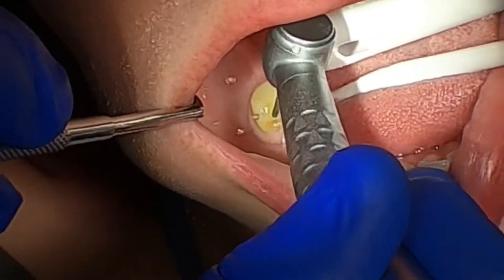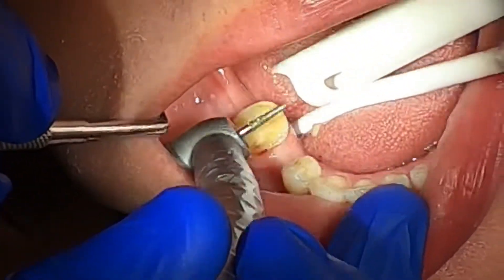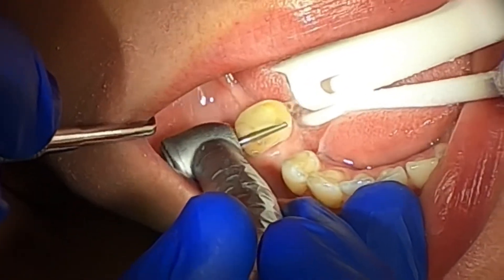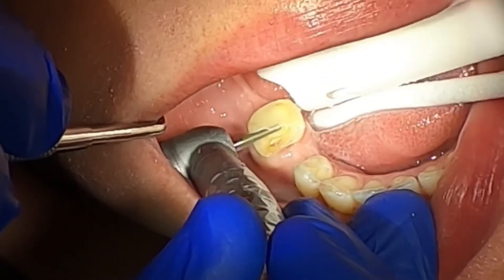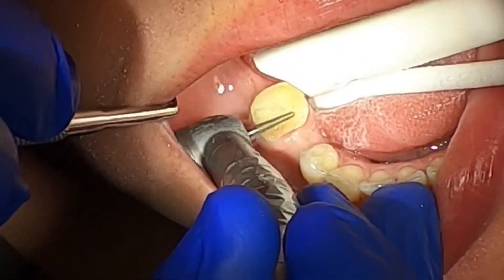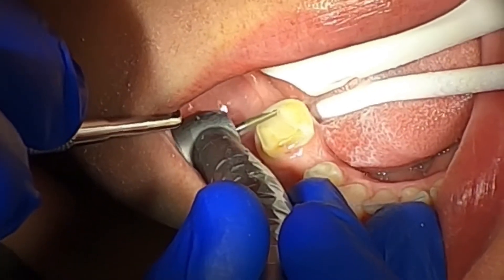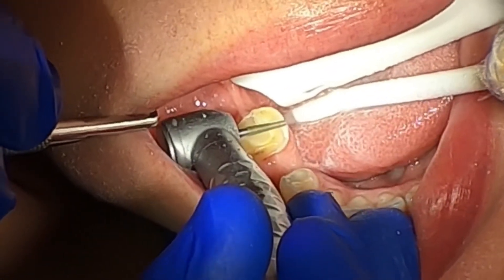The angulation is slightly different from what I see in my 8-power surgical loops, so there are a couple of times where the handpiece or my hand will actually block the view, when in reality through my loops it's not blocked. I'm looking to get a slightly higher-powered ocular for the camera lens so it's not quite as grainy, and I need to update some of the white balance settings on the camera — some of it gets a little washed out.